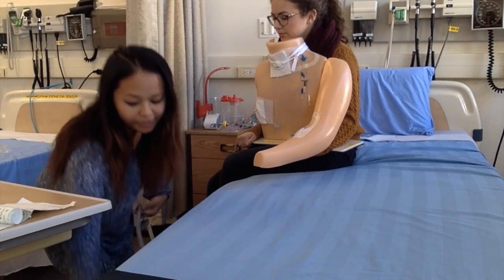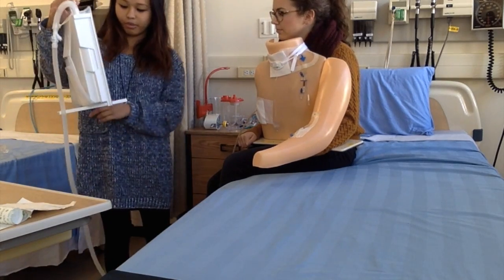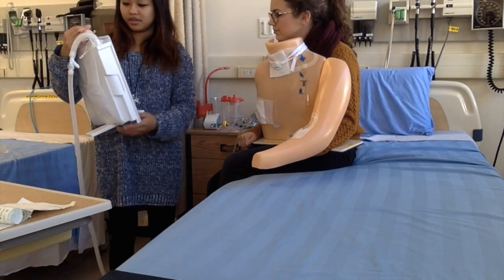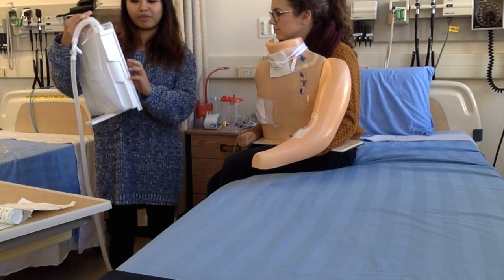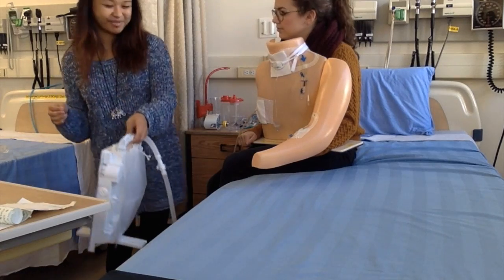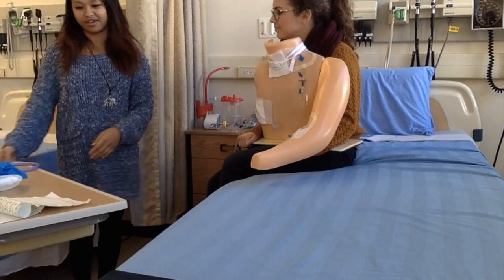Okay. I'm glad you keep the drain below your chest. Okay, and there's no bubbling. That means there's no leakage. You should let me know if there are any bubbles. Oh, and you're up at 100 mLs today, which is a lot better than the past couple days. Okay, so I'll go get you your Tylenol and I'll be right back.